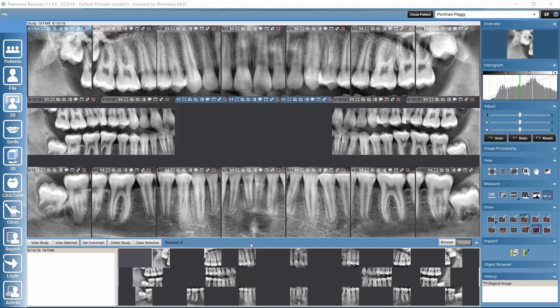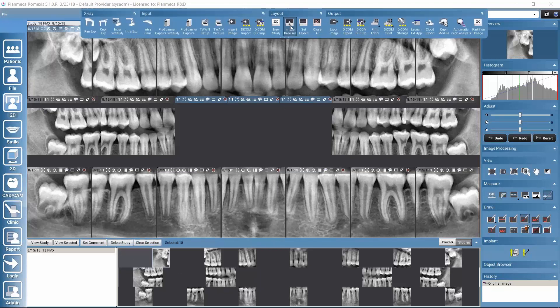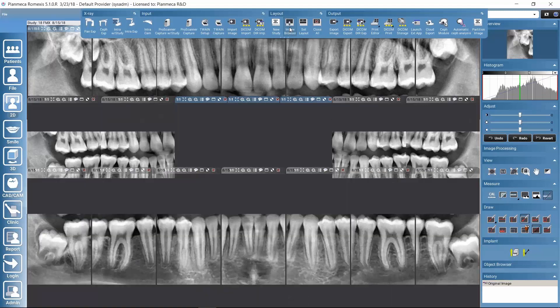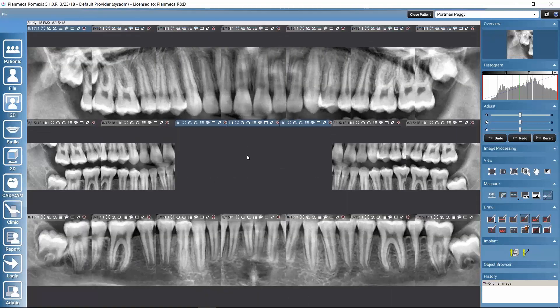The image browser still stays here on the bottom. We could hide it by going to the upper toolbar and clicking the image browser button, so now we have more space for viewing the study.